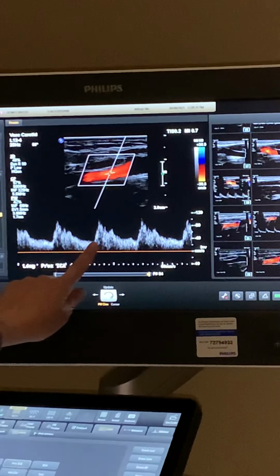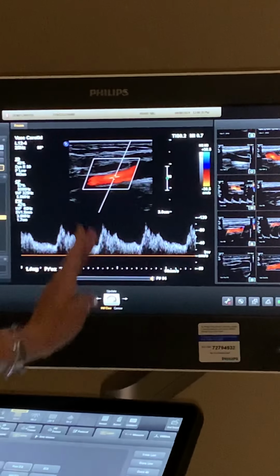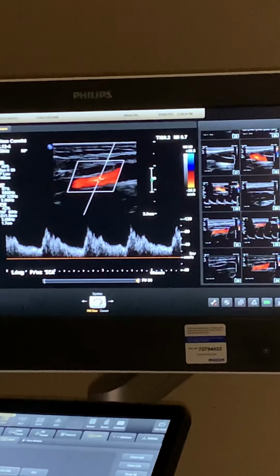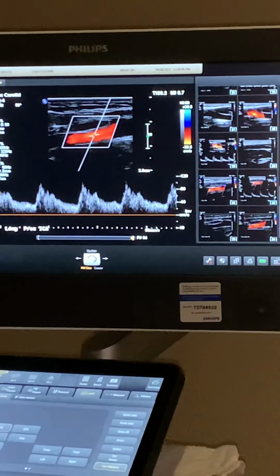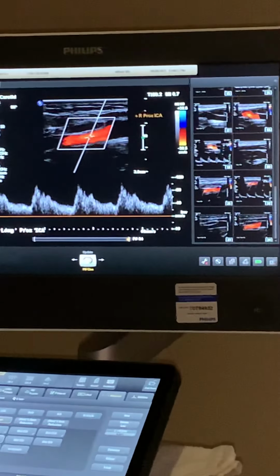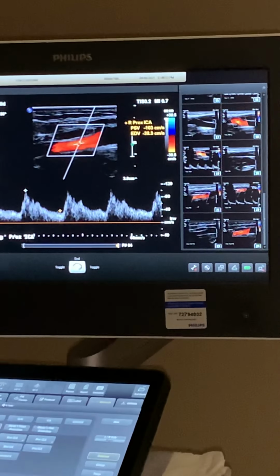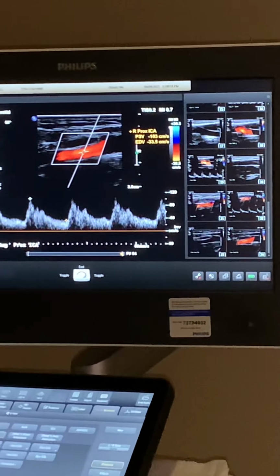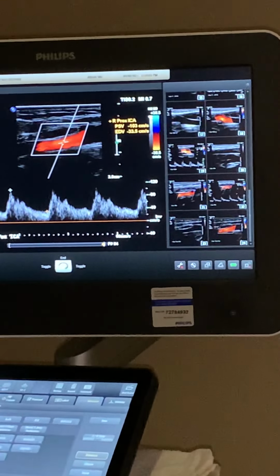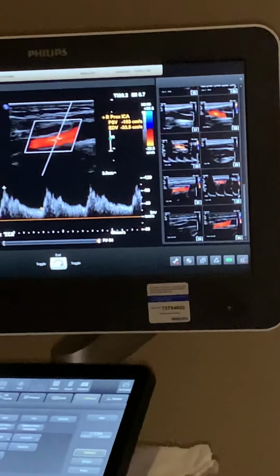So you see here this diastolic is a bit higher, and this systolic is not quite as sharp of a velocity peak. Remember, the ICA waveform takes longer in time. Remember, going from left to right is the time. And so the ICA takes a longer time for it to rise to peak systole and to drop to diastole. Is that because it's more of a continuous flow? Yes, it's because of the bed that it's feeding, your brain.